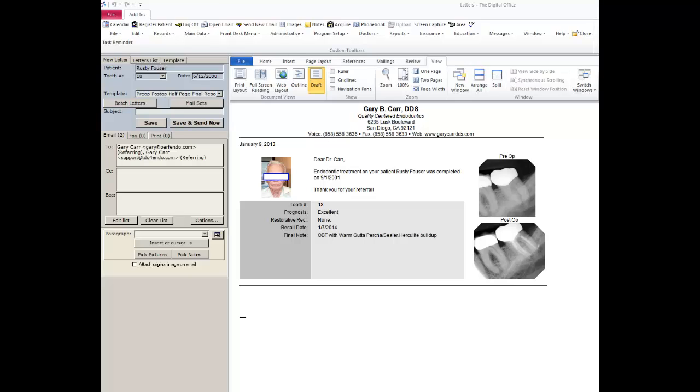This template was configured to be sent to the referring doctor by their preferred method of contact which for this doctor happens to be email. You can send by email, fax, or prints from this page. The only button I have to click is save and send now. And the report is at this moment emailed to the referring doctor, uploaded to your website, and also available as history of what was sent to this doctor.